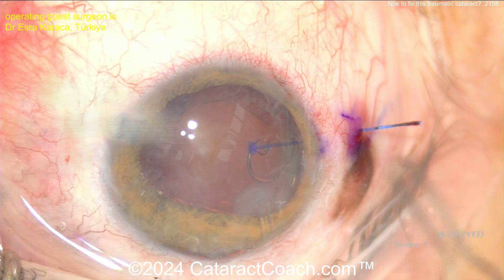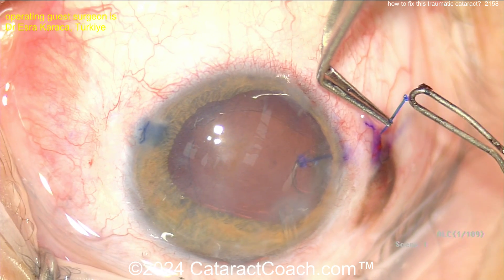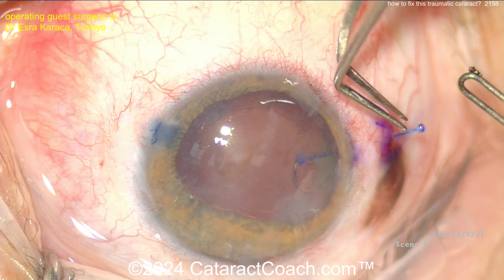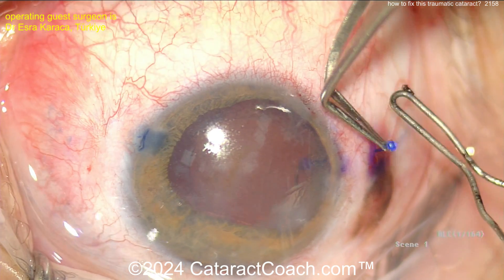You can put a temporary clip or go ahead and measure and then cauterize and create a flange. When you create this flange, don't leave it just sitting under the conjunctiva — you want that flange buried within the sclera. Sometimes I like to do more of an angled approach to have more of a scleral tunnel. That's a big flange — is that going to just sit under the conjunctiva? We're going to find that together.